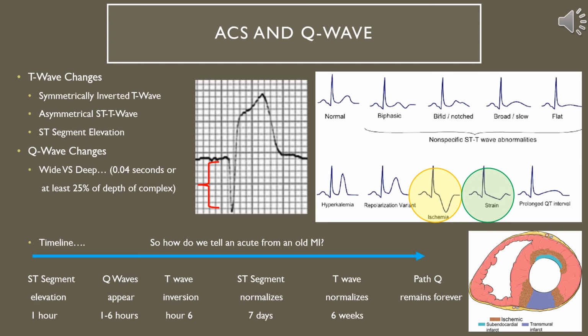Whenever you see one of these acute coronary syndrome changes, you want to confirm in 2 leads in the same lead group. Sometimes you can have an elevation in just 1 lead and it be a non-specific change. This is often notated on EKGs when you print off the 12 lead. It'll say non-specific T wave abnormality.